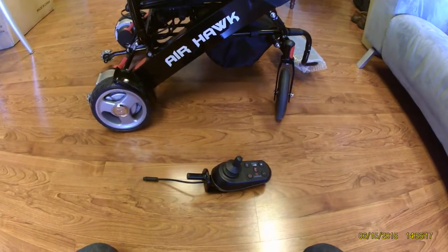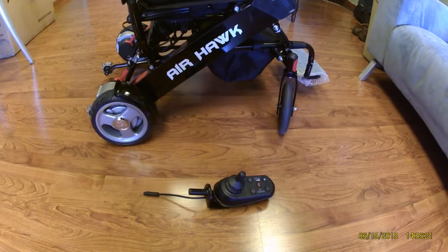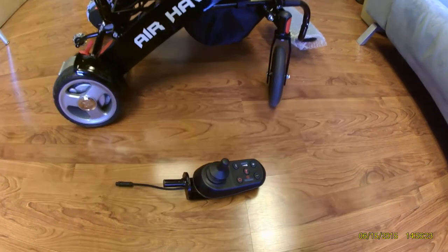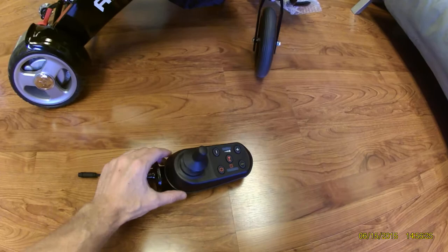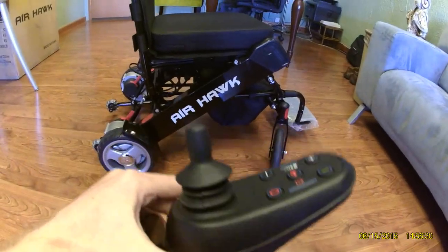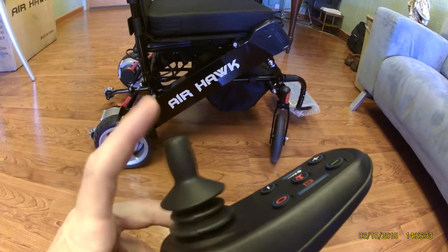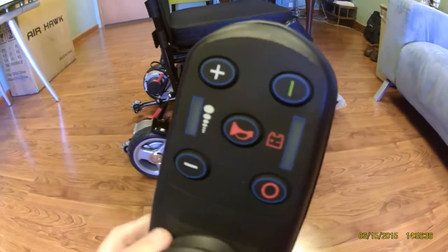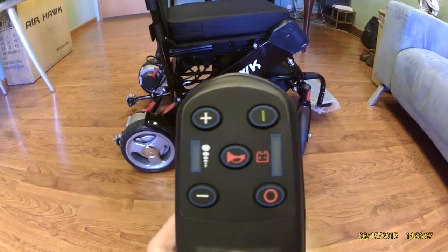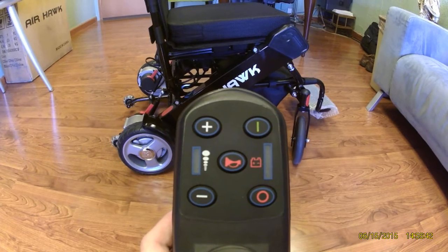Once you get the Airhawk open, there are a couple of features that I would like to point out. We will start with the actual joystick. You can see the joystick is, just as advertised, a single finger can operate it. You have very simple controls on the joystick that I will go over once we get started here.